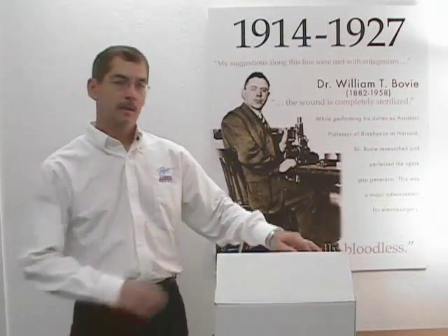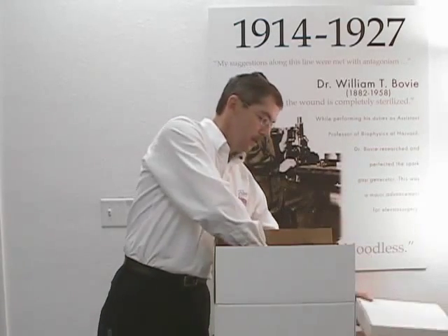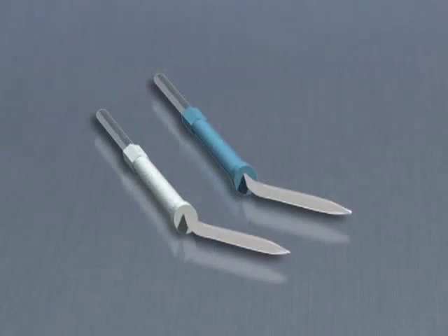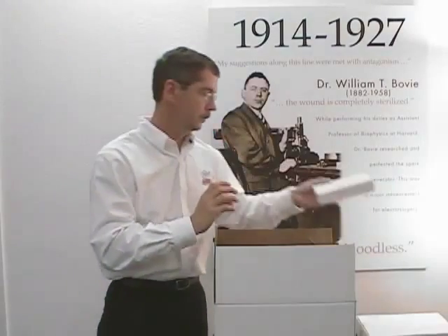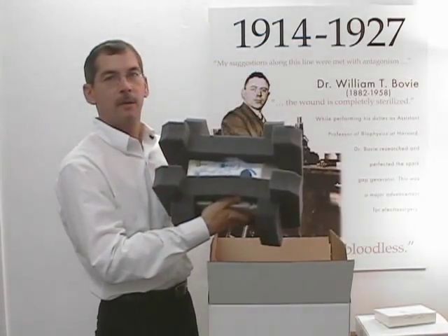When you open your box, the first thing you'll find is an accessory kit. Next, you'll find a box of 100 dermal tips — 50 sharp, 50 blunt. And finally, the ARIN 950 packed in protective foam.